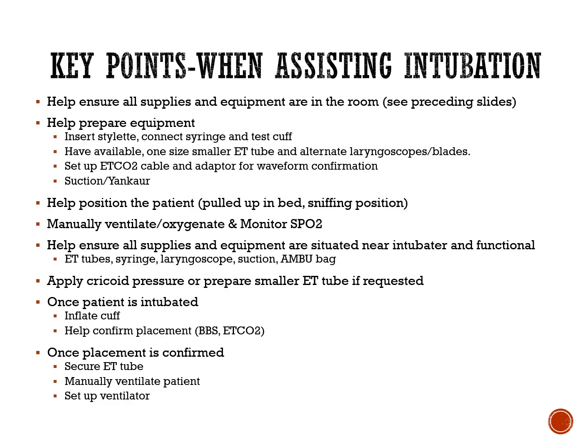Some key points to consider when assisting another, whether it's assisting a physician or assisting your fellow respiratory therapist. Help ensure that all supplies and equipment are in the room. Again, seeing those preceding slides. Help prepare the equipment, inserting the stylet, connect the syringe, test the cuff.